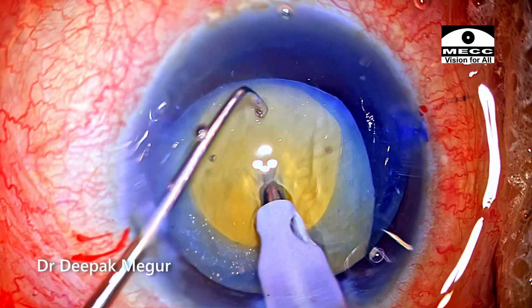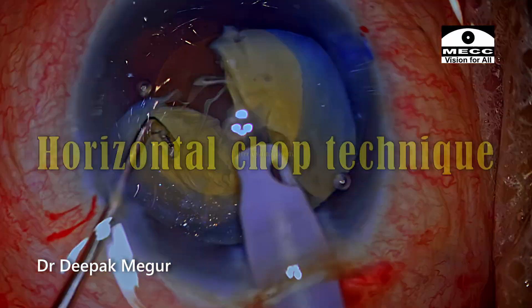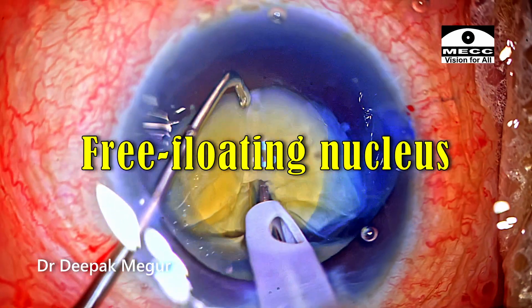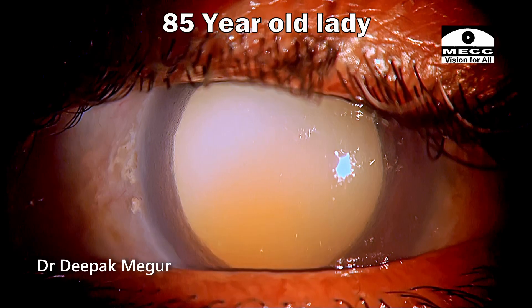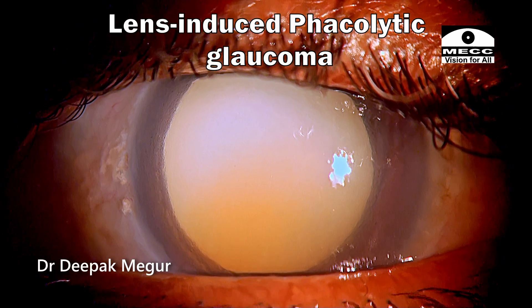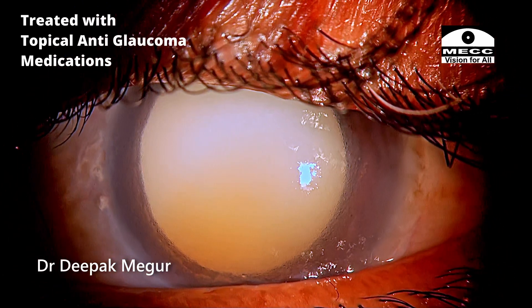Hi, in this video I'll be demonstrating the use of horizontal chop technique while dealing with a free floating nucleus in an eye with hypermature morgagnian cataract. She is an 85 year old lady who has a phacolytic glaucoma. She's on anti-glaucoma medications and anti-inflammatories.